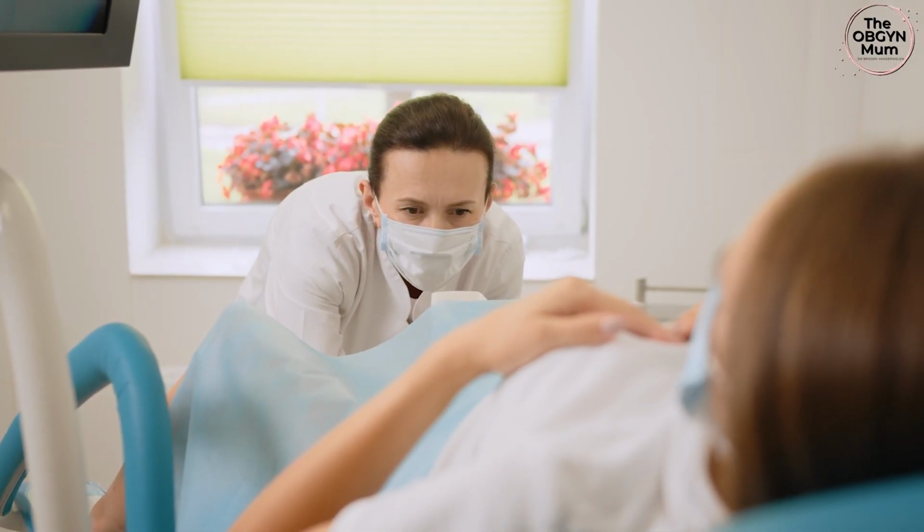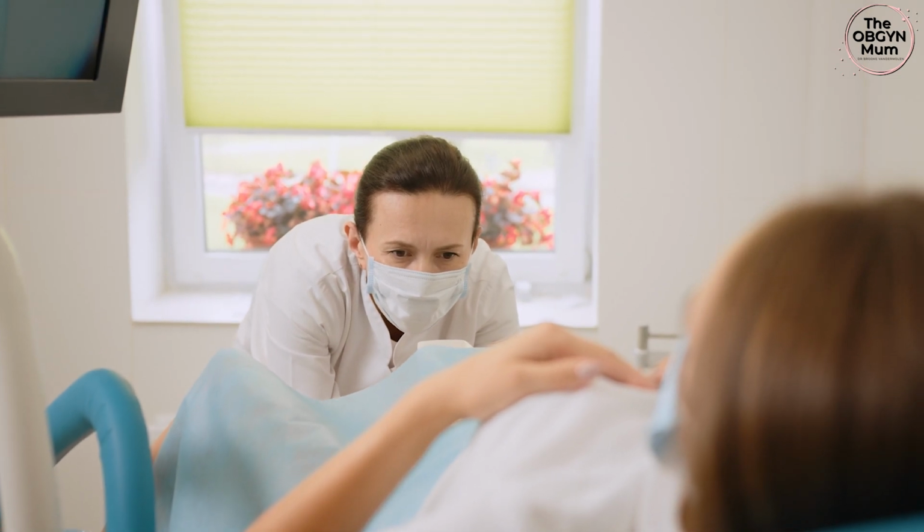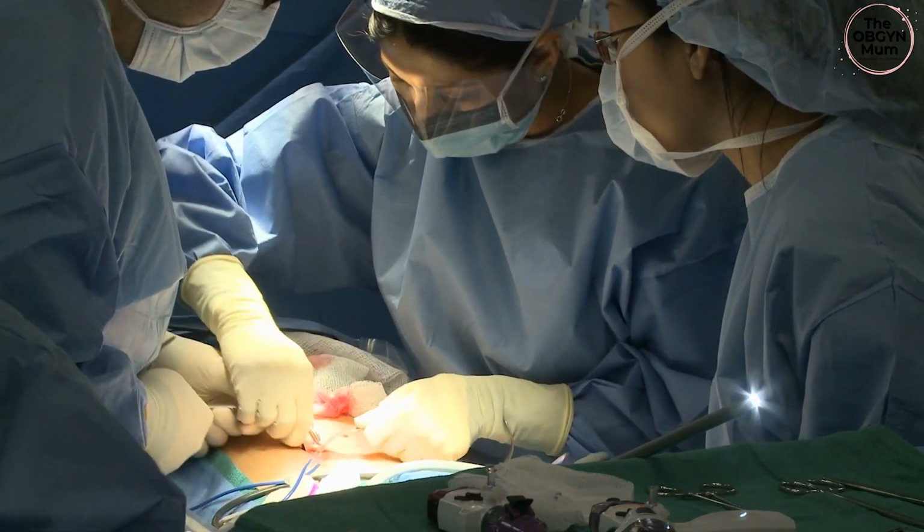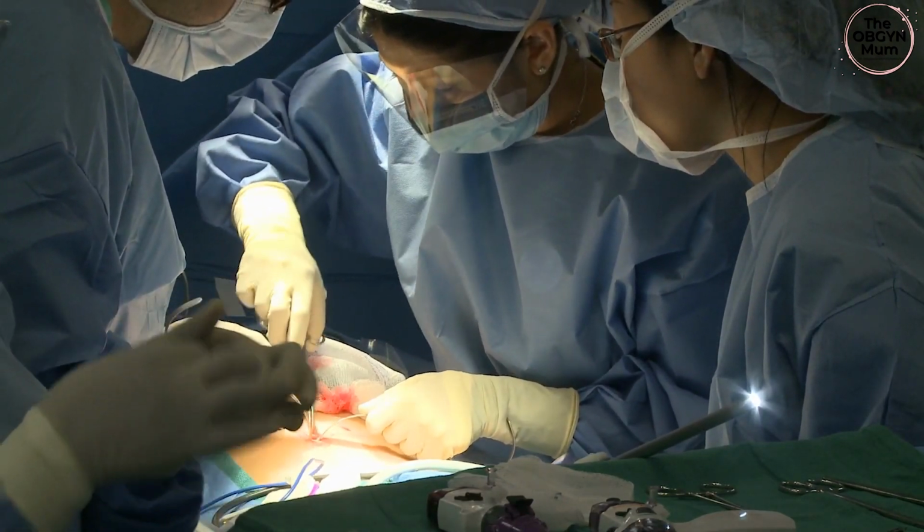The gynaecologist will examine your vagina and your abdomen to assess how big your womb is, and then they'll often place a small instrument on your cervix, on the neck of the womb, via the vagina to help to move the womb during the operation. And this is removed before you wake up, but because you have this placed inside the cervix, you might experience a little bit of vaginal spotting after the procedure, and you might feel a little bit sore down below as well.